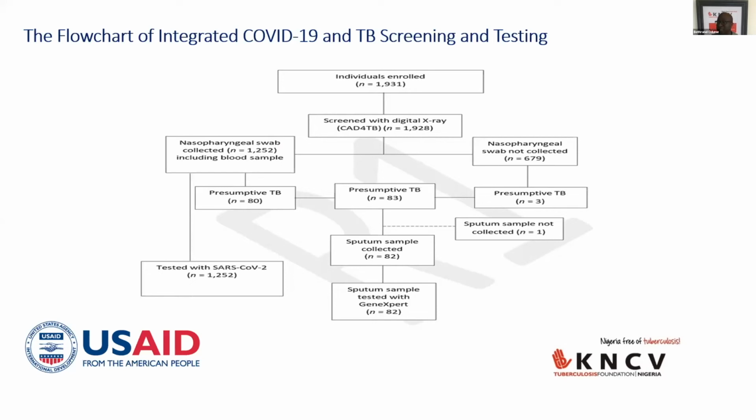You could see that more patients submitted for CAD4 screening, and very few, about 679, declined COVID testing. I've talked about the issues around stigma, which was very heightened during that period of lockdown, isolation, and healthcare facility admission.